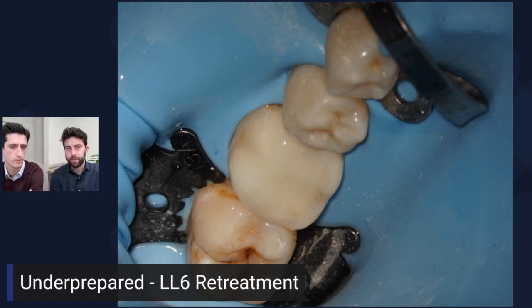This is built up with a dual-cure resin — Corex Flow. The etch and bond protocol is done as standard, then we place the Corex Flow dual-cure composite all in one increment and wait, letting it chemically cure — typically about a minute and a half to two minutes — then do the final light cure, because you won't get complete polymerization without that final light cure on a dual-cure material. This isn't going to win any awards for composite carving, but there's just a point contact and not much overbuilding, so it's not taking huge lateral excursion hits. This tooth is going for a crown pretty soon.